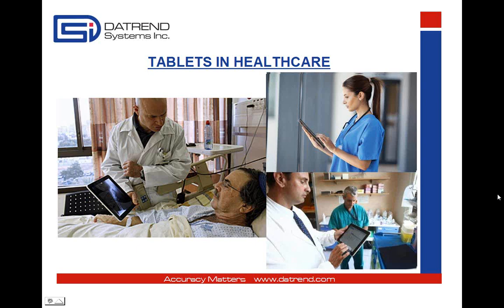Okay, well, let's leave behind the technology of the 90s, and we're going to jump ahead to now. Over the last few years, the use of wireless technology and inexpensive mobile computing devices, and in particular tablets, has expanded greatly in the hospital. There's an obvious benefit to medical imaging, where a tablet can be used to replace film. They're being used by nurses to do the charting, to reduce the errors that you can get with paper records. They're also handy just as an internet device for Googling symptoms, side effects of meds, and things like that. To support the increasing use of smartphones and tablets in the hospital, the wireless infrastructure needed to support them has also grown.